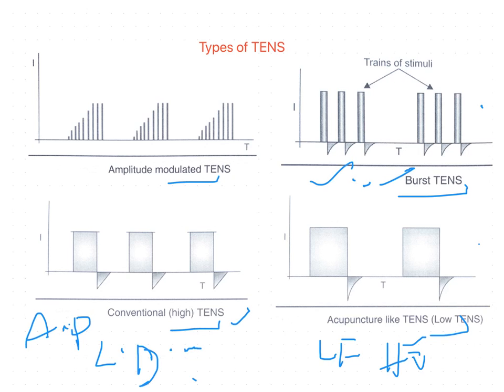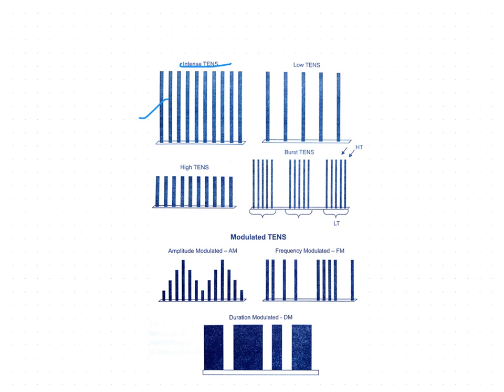Okay, and another one is the brief intense TENS. So here we can see the intense TENS, how it is applied. The waveforms are like this. This mode is used to provide rapid onset but short-term pain relief during painful procedures which are done by the clinicians, such as wound debridement, joint mobilization, etc. So that is about the intense TENS.